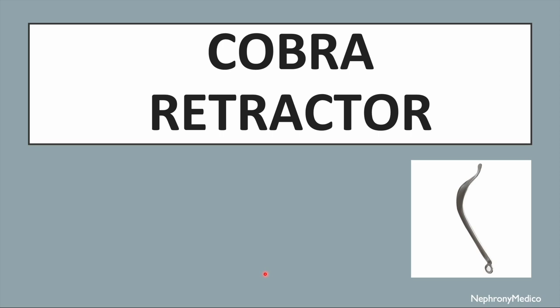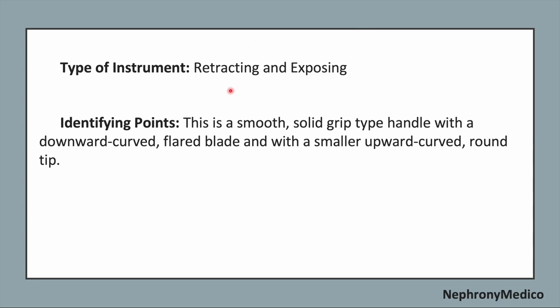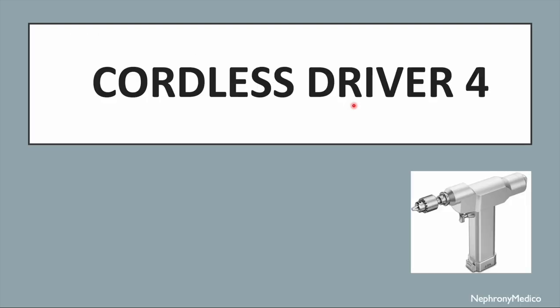Let's talk about Cobra retractor. This is a picture showing Cobra retractor. It is a retracting and exposing type of instrument. Now, identifying points: this is a smooth, solid grip type handle with a downward curved flare blade and a smaller upper curved round tip. Use: it is used for the retraction of large areas of tissue. The large bend in the blade allows tissue to be retracted far away from the field, allowing for better visualization. Important point to remember: there is no pulling needed when holding this retractor after it is placed, simply hold the handle down or back.